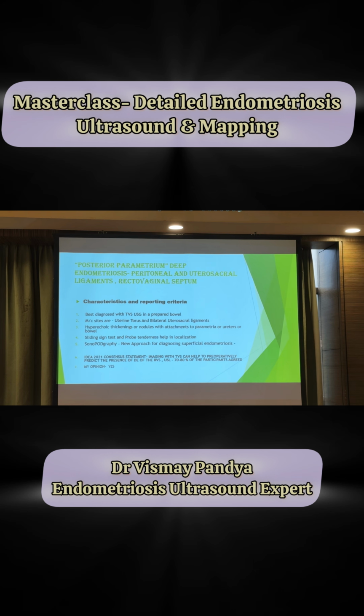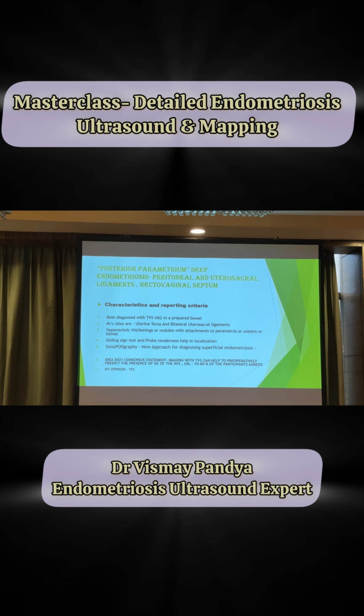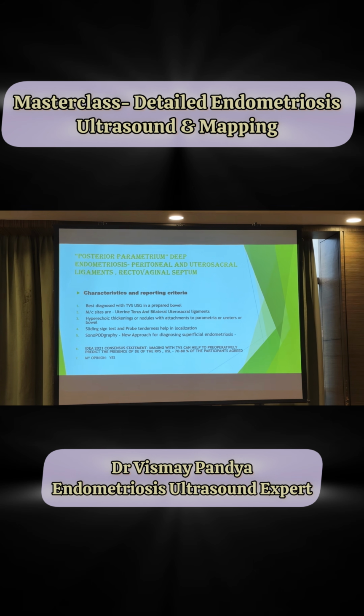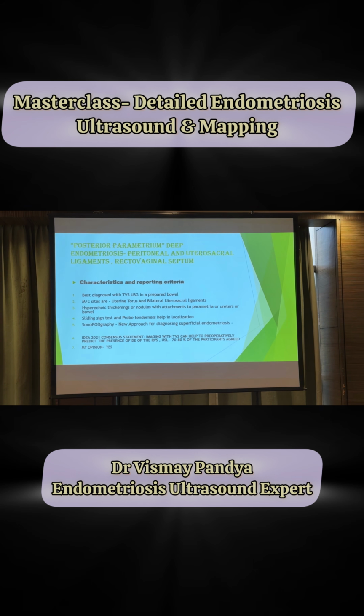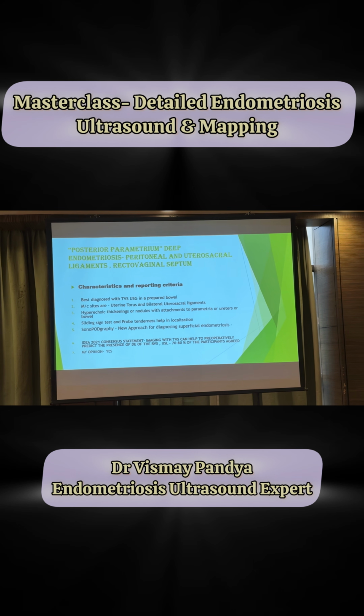So this is very good for diagnosing something called superficial endometriosis. And as someone was telling, for now we have so many patients who have chronic pelvic pain, but there is no diagnosis for it. So you can try this sonopodography, and it has worked for us actually. We have diagnosed 2 to 3 patients by doing this.